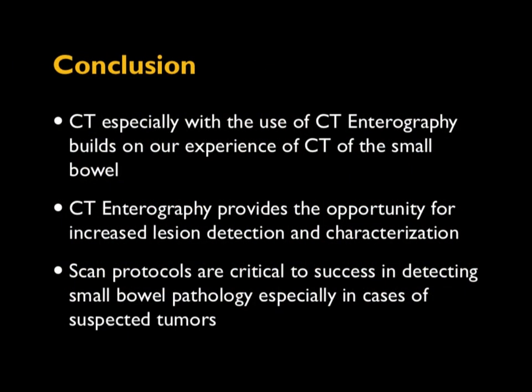So I've now gone through with you primary and metastatic tumors. I've showed you some of the challenges in diagnosis. I've shown you many of the pearls. I've showed you many of the pitfalls. You see from the articles, we should be able to pick up nearly all tumors.